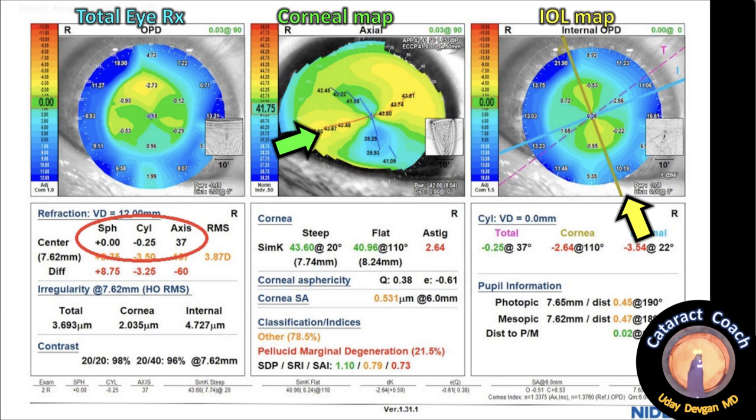Looking at the scan in more detail: on the right side in yellow is the IOL mapping, with the yellow arrow showing the steep axis of the toric IOL. The middle image in green is the corneal map — the green arrow shows where the steep axis of the cornea is. You can see how the steep axis of the IOL and the steep axis of the cornea are going to eliminate and neutralize each other. The IOL reads minus 3.5 diopters at 22 degrees; the cornea is minus 2.6 at 110 degrees; the total is only minus a quarter at 37 degrees — fantastic. The cornea and the IOL look a little different because of vertex distance: the IOL is at the IOL plane, and the cornea is at the corneal plane. Circled on the left in red is the refraction — plano minus a quarter at 37. Amazing.